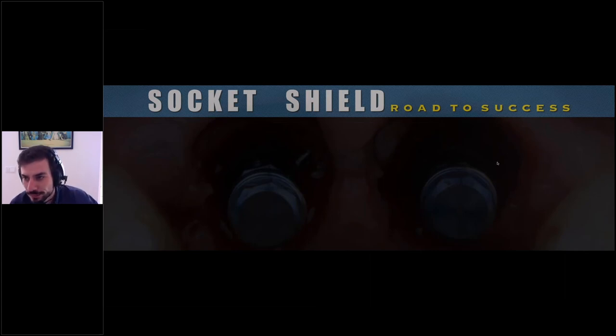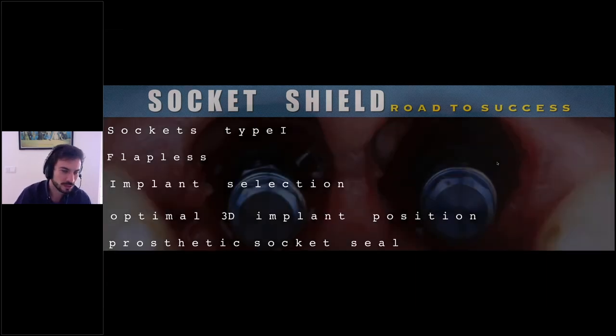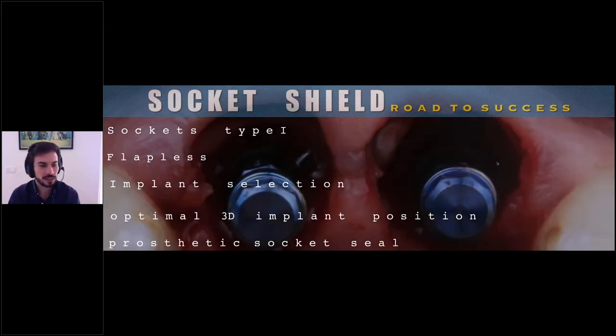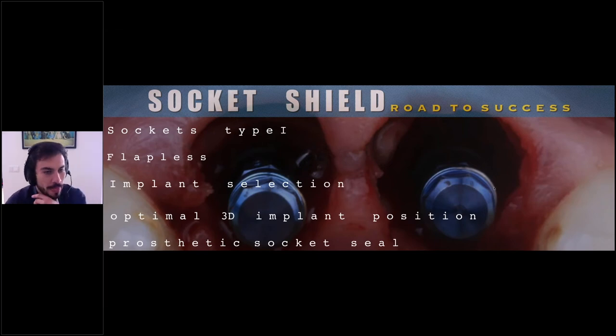So, the socket shield road to success. Socket shield, we should apply it on type 1 sockets, in which, I guess, if we can go flapless in the esthetic zone, we'll have better results.